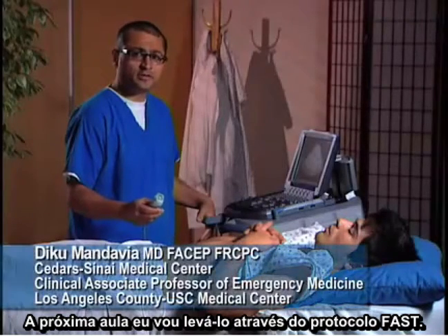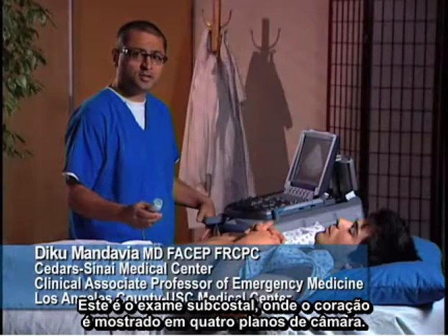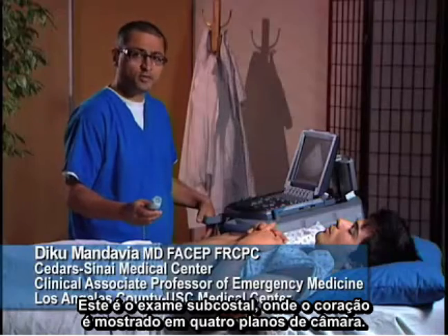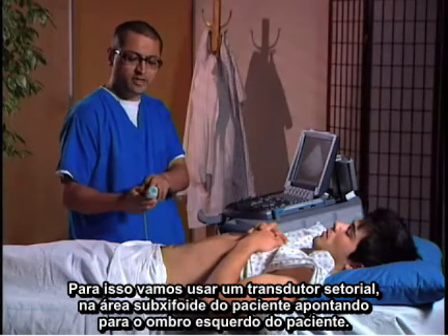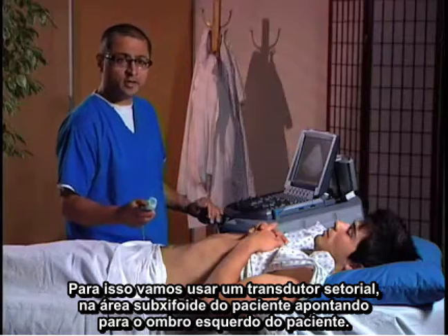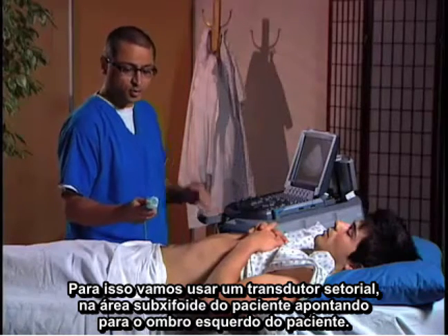The next view I'm going to take you through in the FAST exam is the subcostal view of the heart in a four-chamber plane. For this, we're going to put our transducer — the phased array — to the subxiphoid area aiming toward the patient's left shoulder.